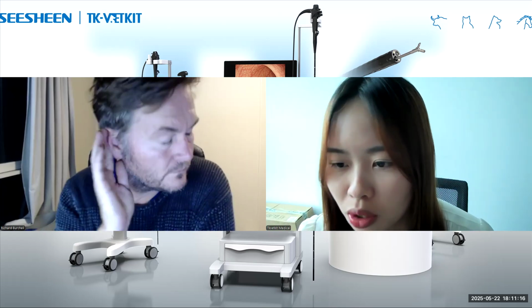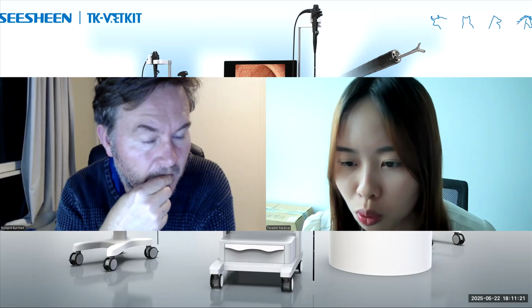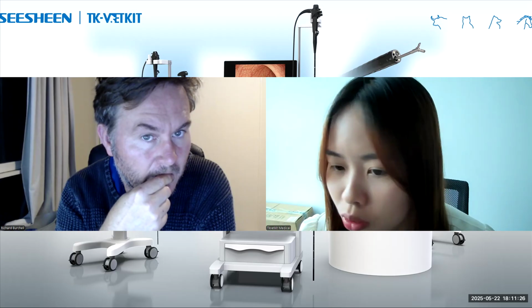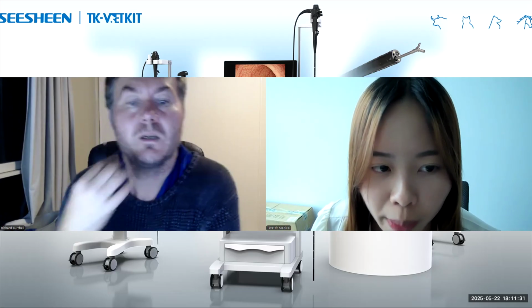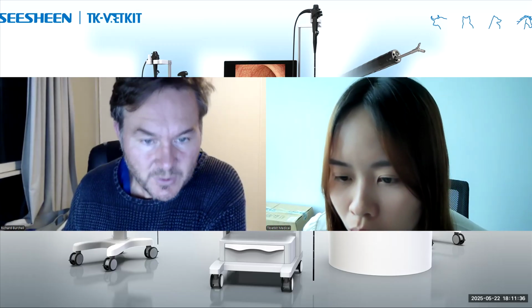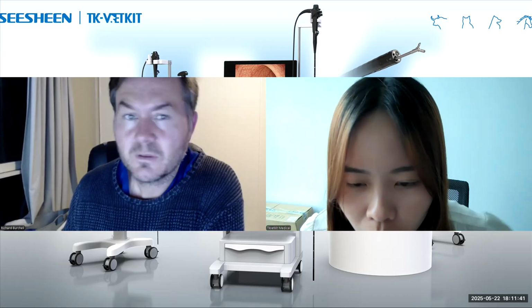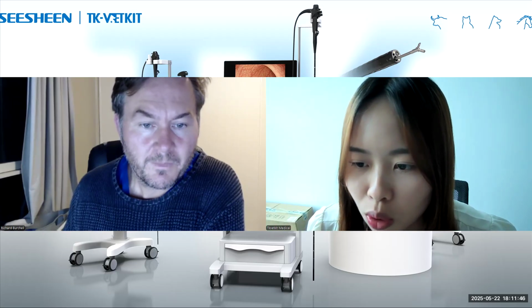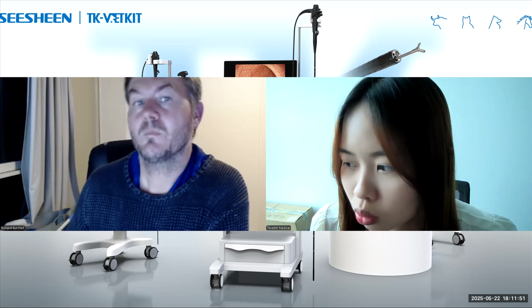They ask, can we use the same probes that we use for rhinoscopy to go to the trachea, maybe? Trachea. Can you see the chat box? I can see the chat box, but I don't see that one. Did I miss it? Can we use the same probes that we use for rhinoscopy to go to the tracheas?